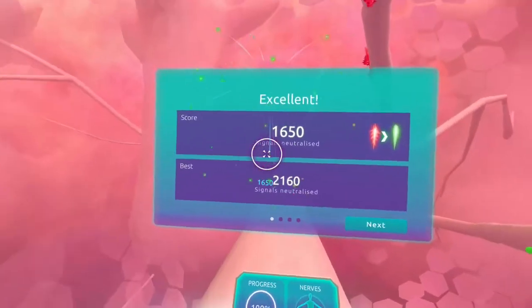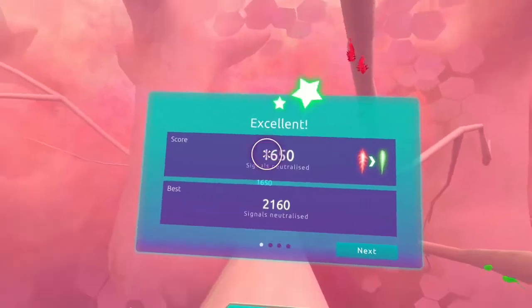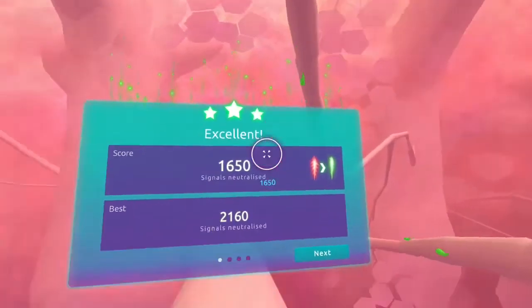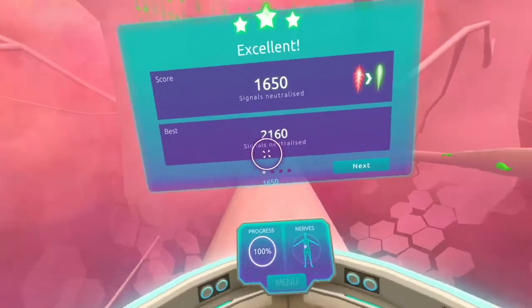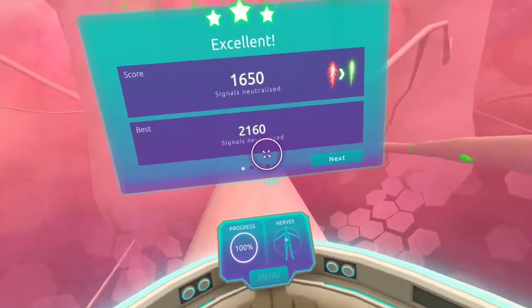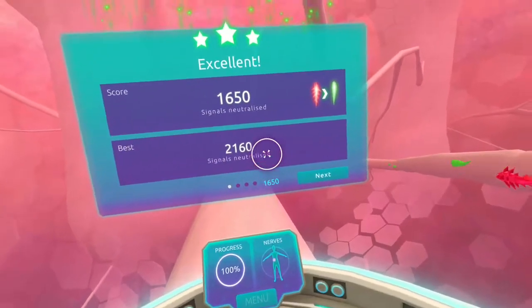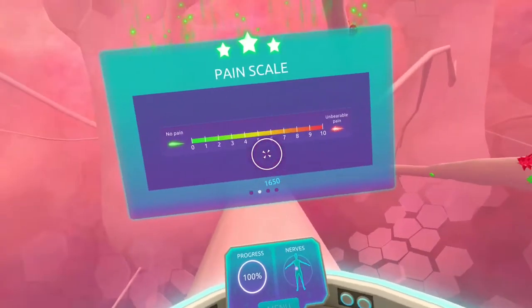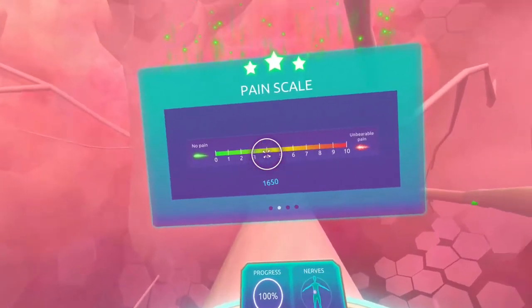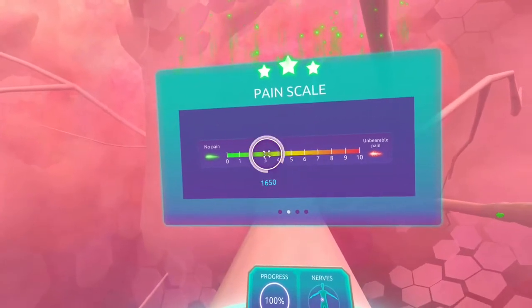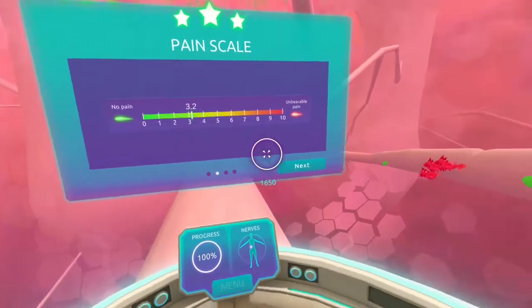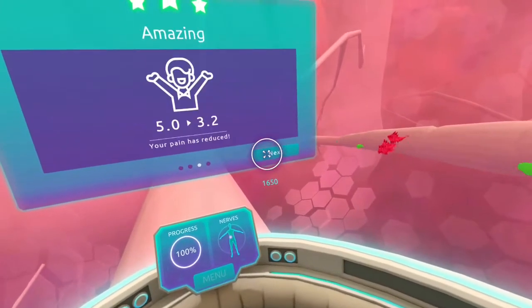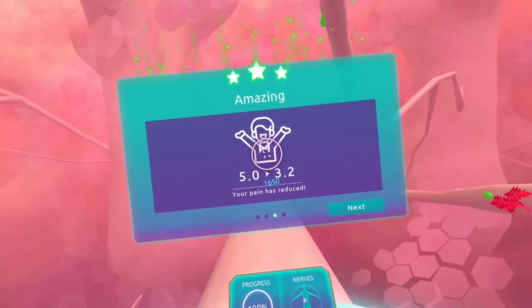That was nicely done. After the level is complete, the player is asked to fill in their pain score again. Measuring their pain before and after completing the level allows us to constantly improve Redisept along this key performance indicator.